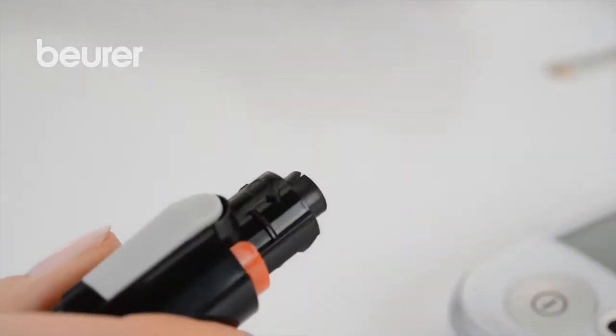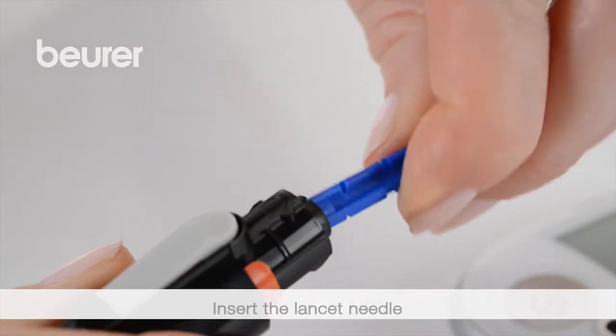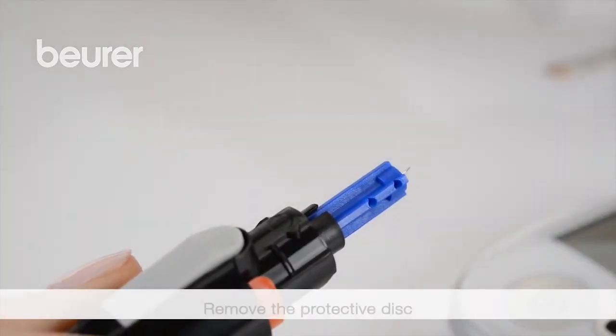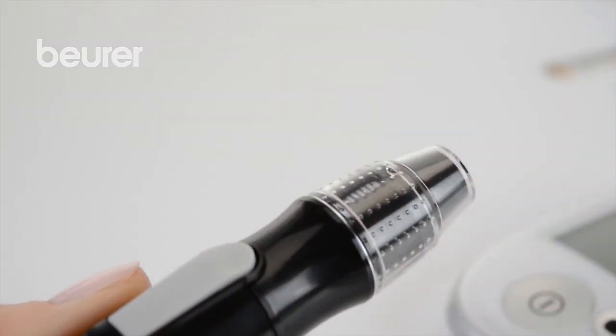For the measurement: remove the cap from the lancing device. Place the lancet needle into the lancing device and secure it. Remove the protective disc from the lancet. Place the cap back onto the lancing device.